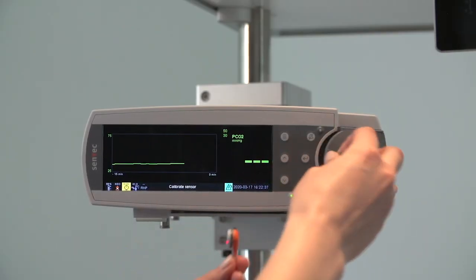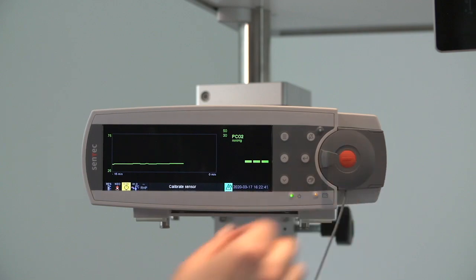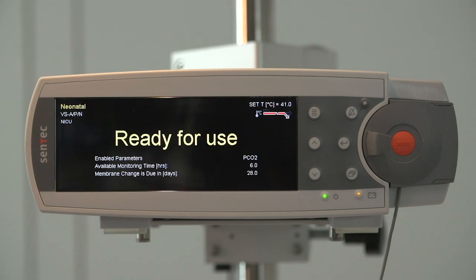Once the sensor is clean and you have determined that it is intact, place the sensor back in the docking station. When the screen reads 'ready for use,' you may begin patient monitoring.